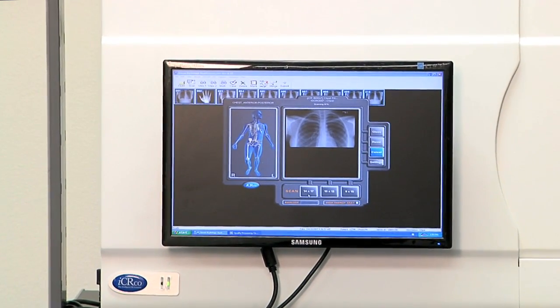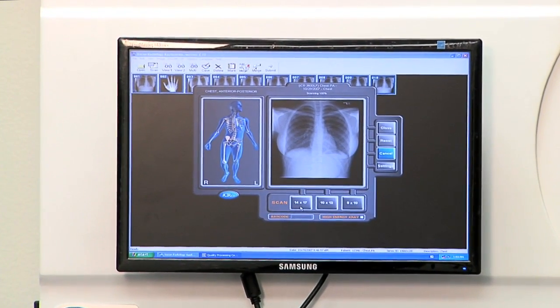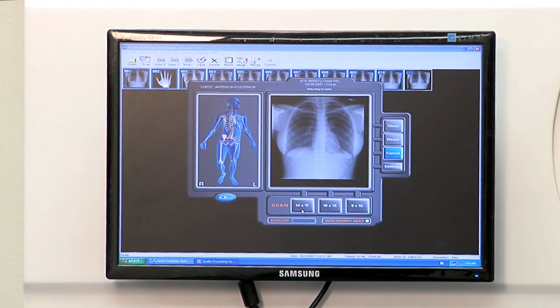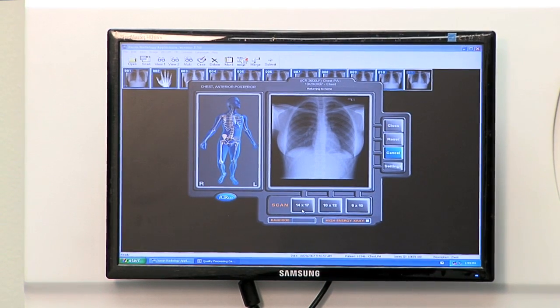ICR 3600 is also the only system with one moving part, ensuring maximum uptime and easy serviceability. With the powerful Xscan imaging software, ICR 3600 completes a full cycle in less than 45 seconds.